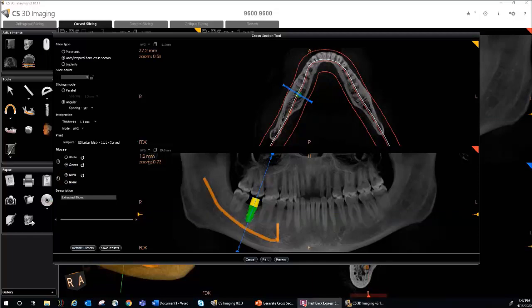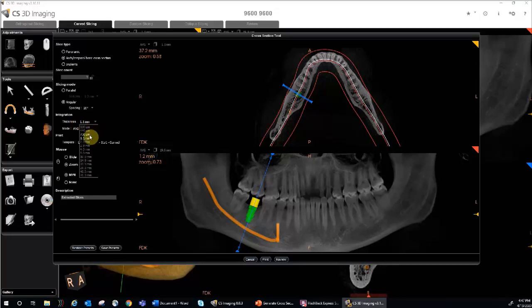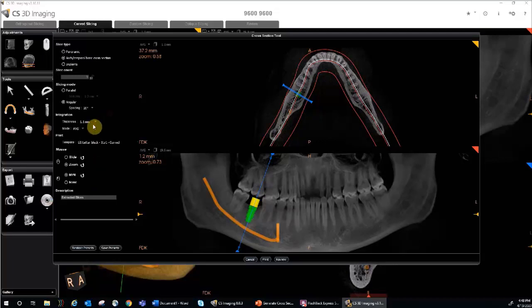You can set the integration thickness with the drop-down. You can go everywhere from the native resolution all the way to the thickest slice. You can also choose the display mode using AVG, which is average, or MIP, which is maximum intensity projection.